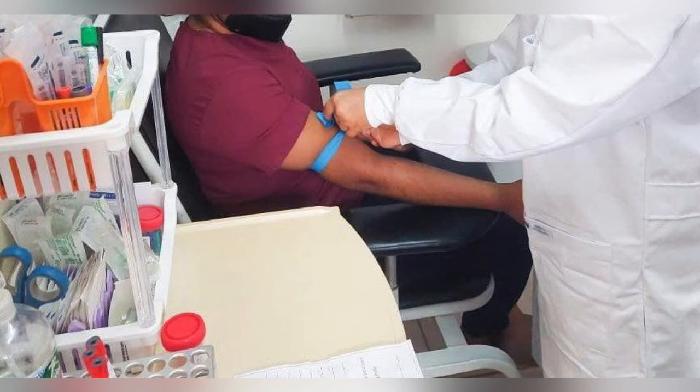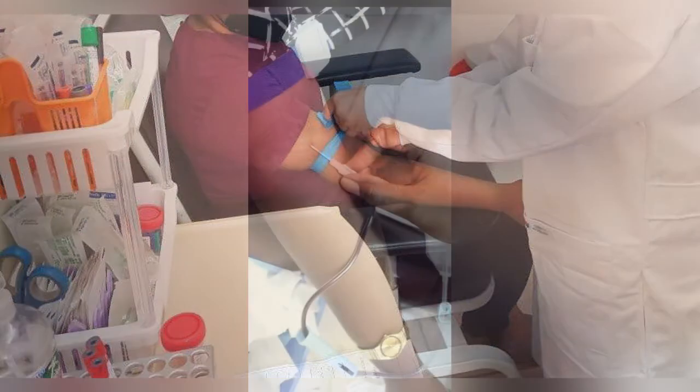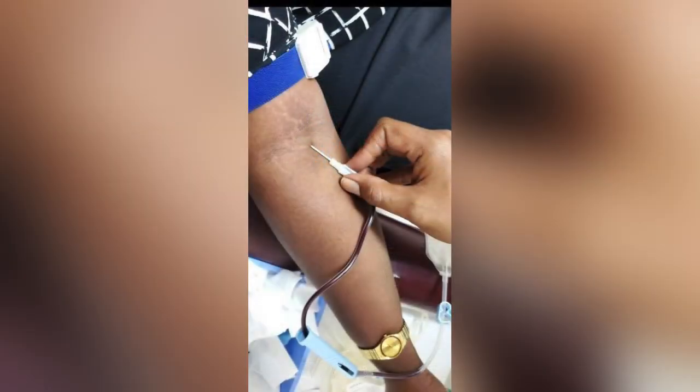Clean and air dry site. Prepare equipment and put on gloves. Reapply tourniquet, uncap and inspect needle. Anchor vein and insert needle. Establish blood flow and release tourniquet.